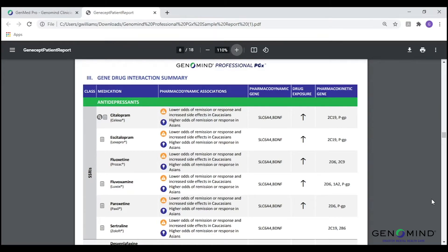An up arrow in this column identifies increased drug exposure, whereas a down arrow would represent decreased drug exposure. At times, you may also see an up and a down arrow together. This would mean that the patient has variants that are affecting drug exposure in opposite directions, making it difficult to predict the overall exposure for that particular medication. Access to a patient's personal drug exposure may prompt a clinician to consider alternative medication options or to implement a personalized dose.